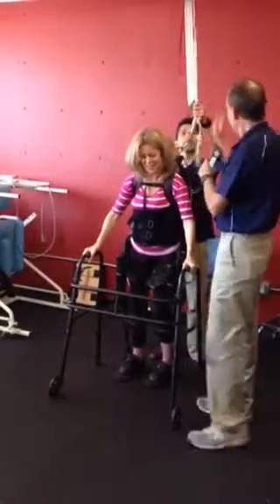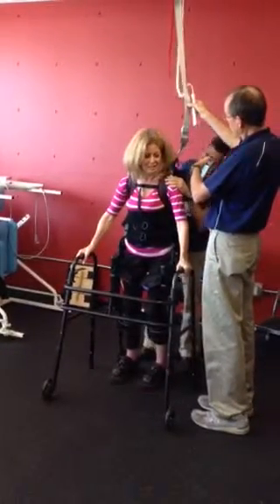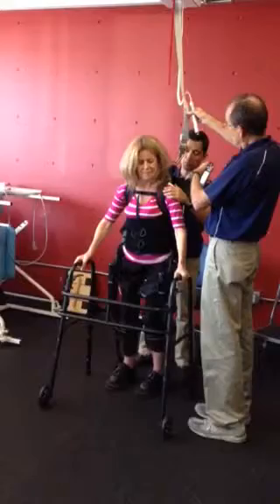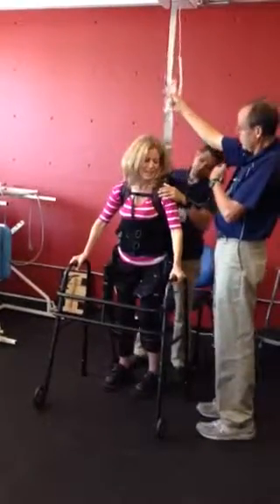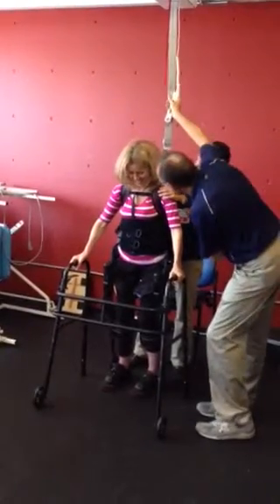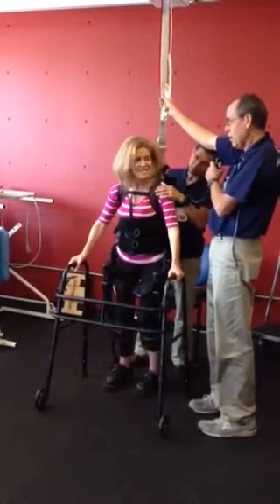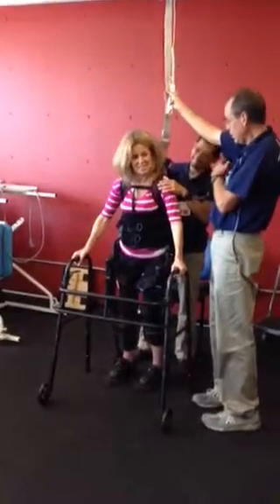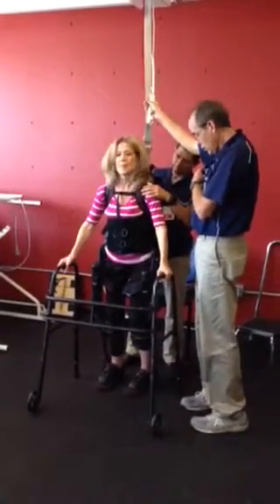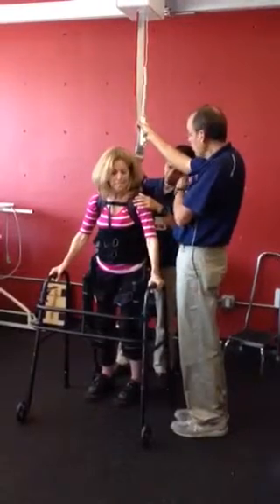I'm so afraid to do this. You're going to be good — you're going to like it. So I'm going to hold one hand here and one hand on the other side. I promise you're not going to fall. That beeping means everybody will take a step. It's not going to just keep walking on its own — we have to press it each time. So we can pause any time. Sometimes we'll say pause, and we'll have you push down on your hands and bring your feet together.